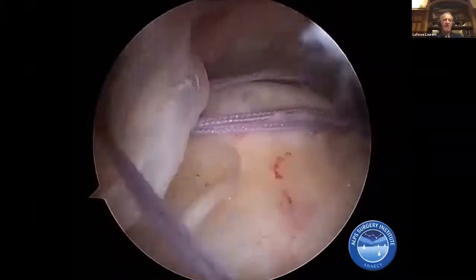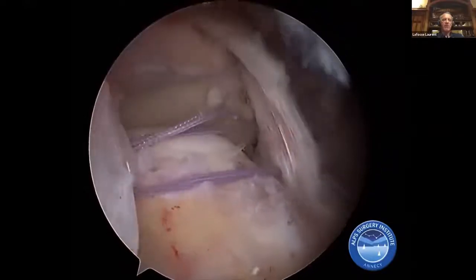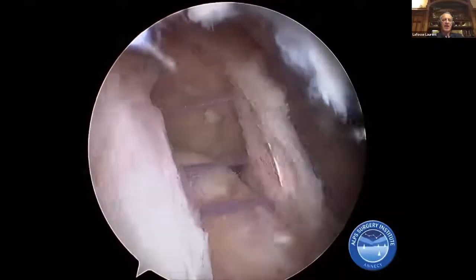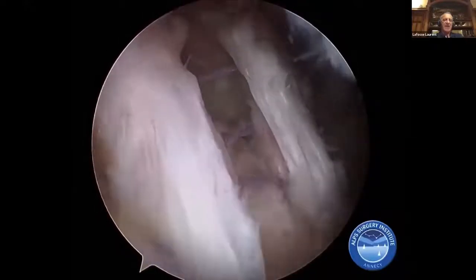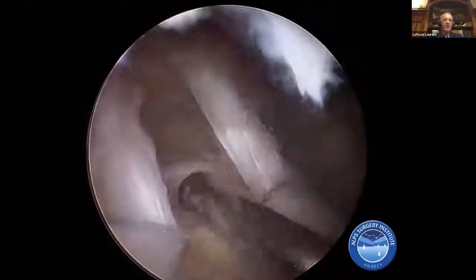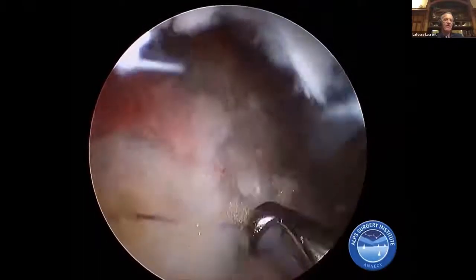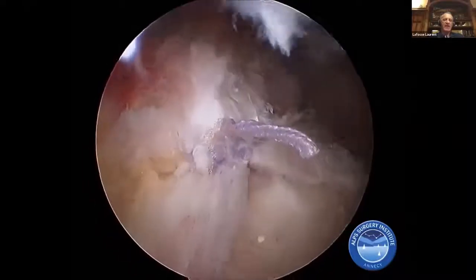And when you have these 3 loops here and the suture, then you will pull on both sutures, and progressively, what is interesting is that the side-to-side will automatically be balanced as a permanent traction, which is a balanced traction from medial to lateral, avoiding an excessive traction, lateral or different traction from the lateral one to the third one. That's it.